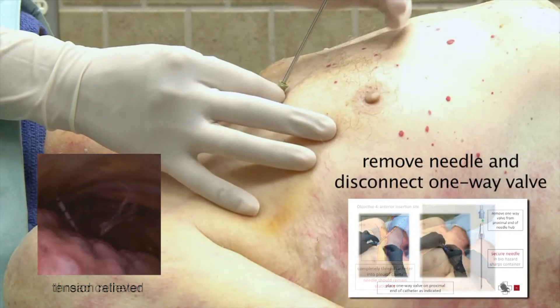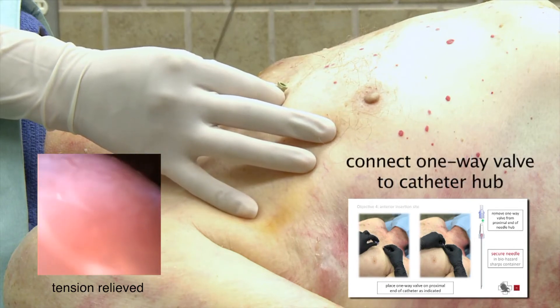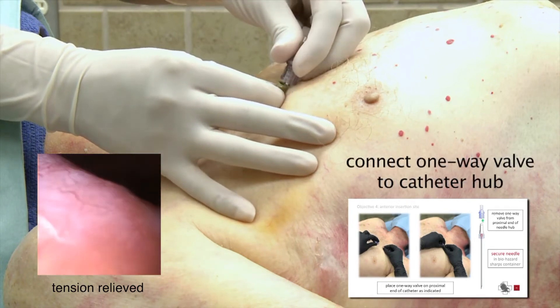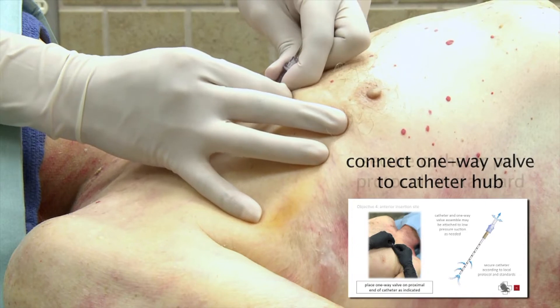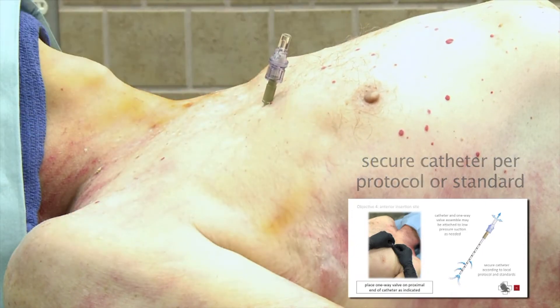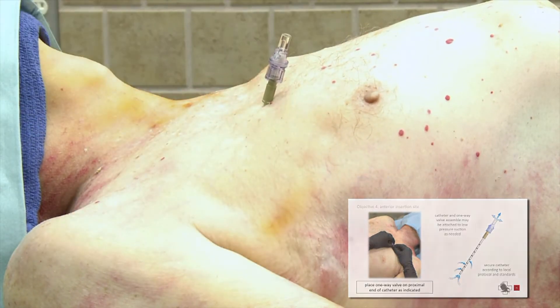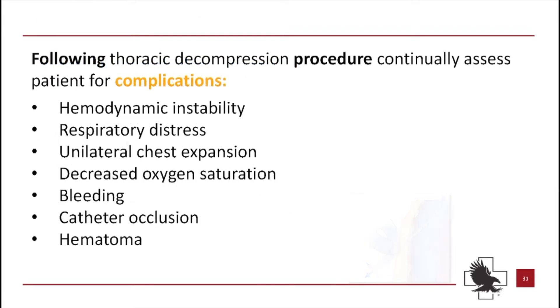Remove needle and disconnect one-way valve. Connect the one-way valve to the catheter hub. Secure catheter per protocol or standard. Monitor your patient for successful decompression or the development of any complications. Be safe.